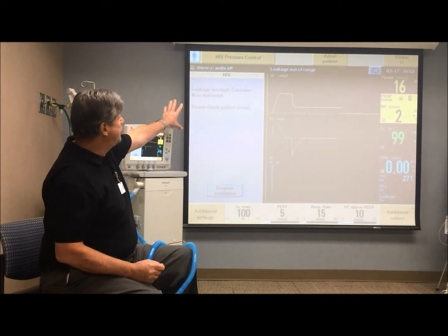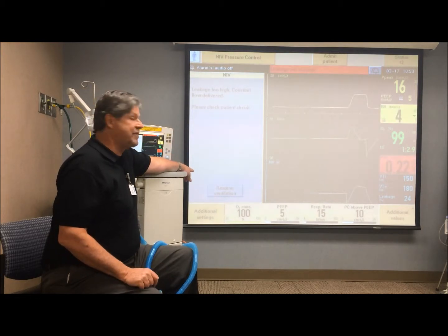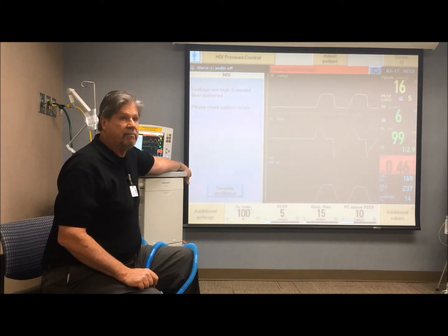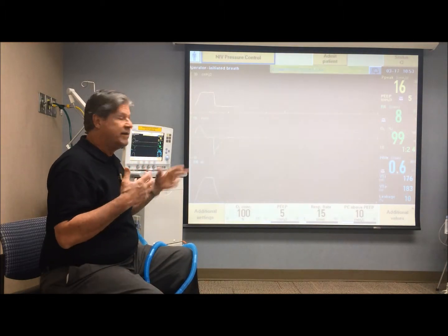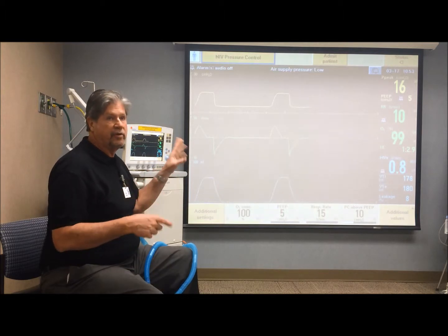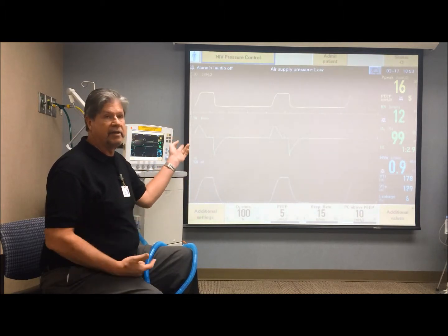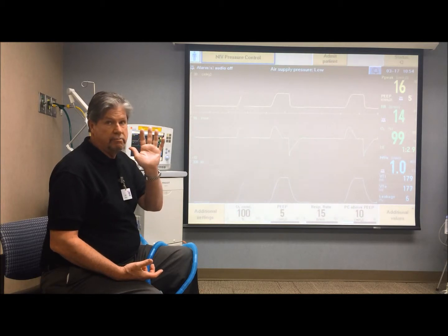This message will be there for another couple of breaths and then go away by itself, and you do not have to hit the resume ventilation button. If you want to, you can, but the alarm will still be there. It just happened to go away when I hit the alarm. It would still be there for another breath or two and then go away by itself, or you can silence the alarm. So that's your excessive leakage alarm that occurs.